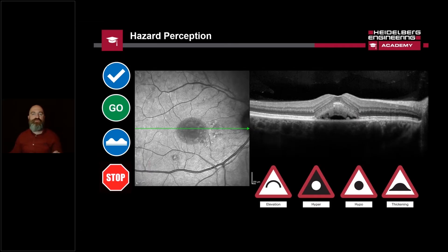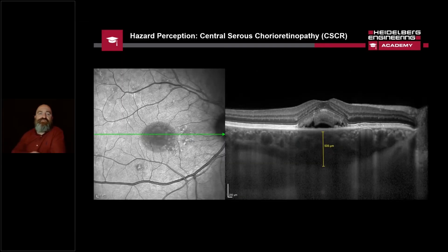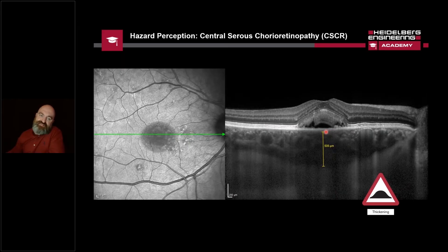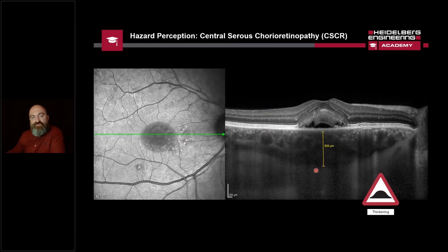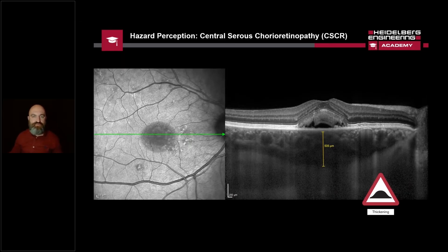By using the iWay Code, without even saying the diagnosis, we've got an extremely high quality description of the pathology. We could even refer that without saying what the diagnosis is. This is a patient with central serous chorioretinopathy, abbreviated to CSCR. A further hazard sign is shown with the enhanced depth image using EDI-OCT, showing us that the choroid is also very thick. The choroid really should be about the same thickness as all the retinal layers, and when it's double that — as it is here at the fovea — that's showing us a very thick, stressed choroidal structure, which is very common with CSCR.